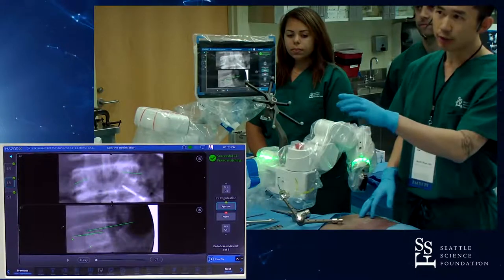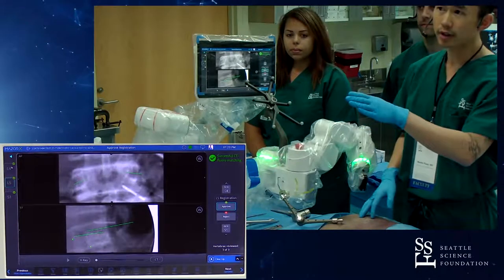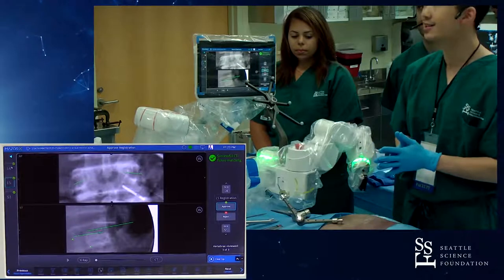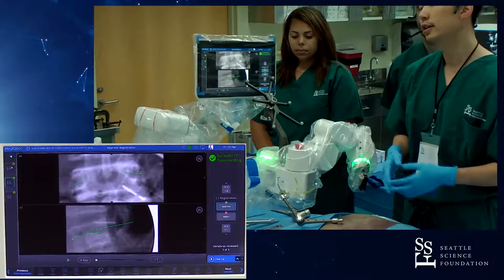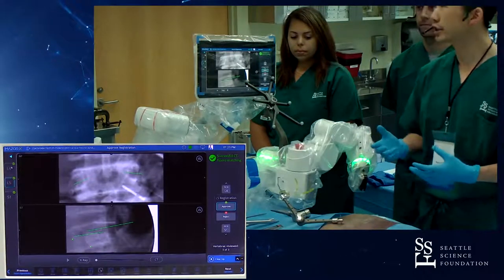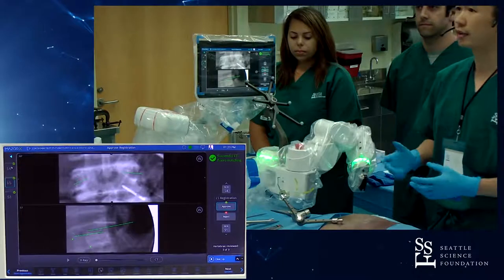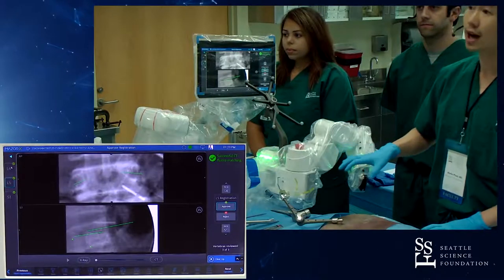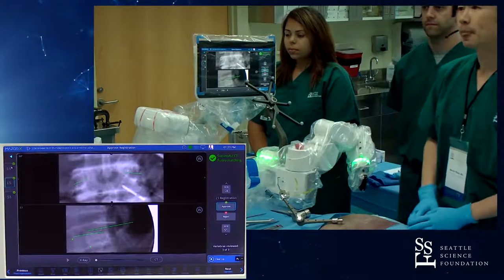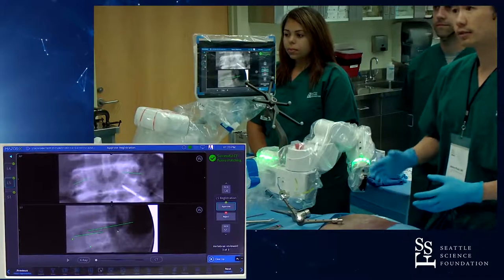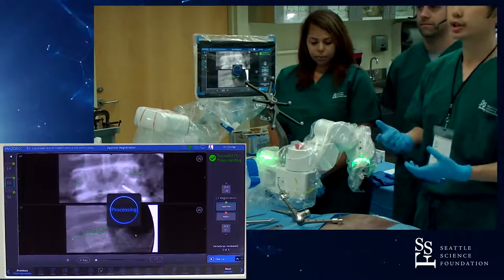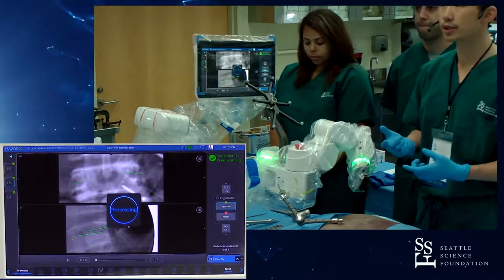You can see on the software those check marks on the left show that the registration is less than a millimeter. If it's yellow, it's one to two millimeters. If it's greater than two millimeters off, the arm will not allow you to proceed. Once that's done, the arm can then be sent to the first position and you can start putting in your instrumentation.